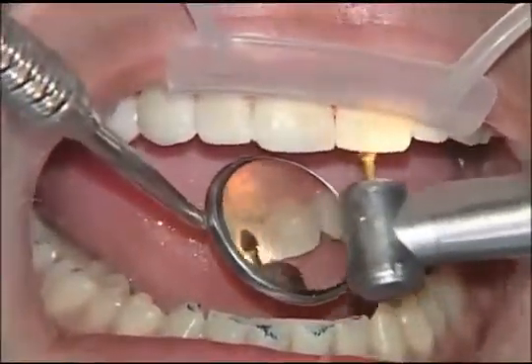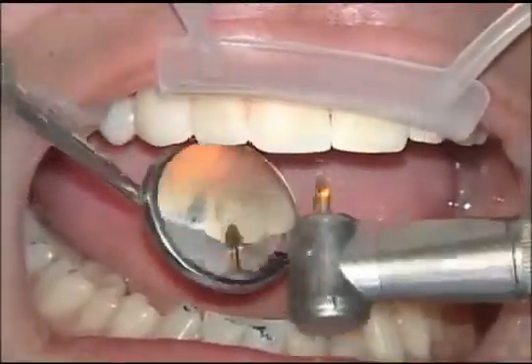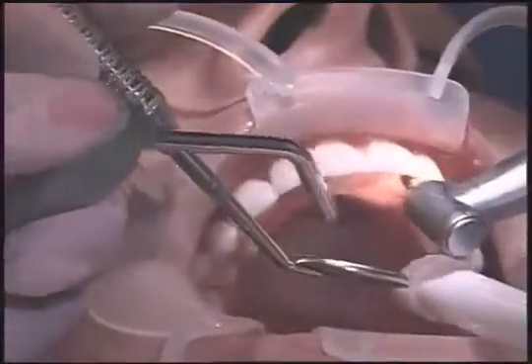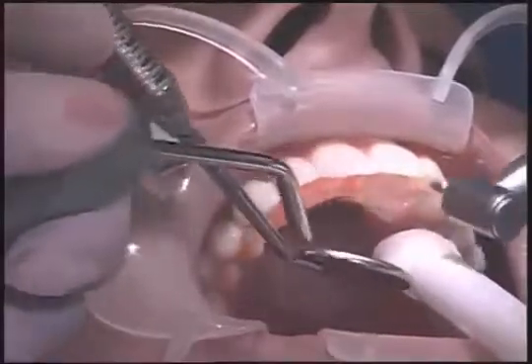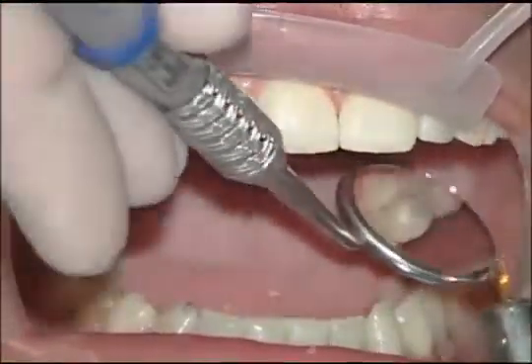So we use the 7408 to not only remove any excess cement, but to take care of any excursive areas that we want to remove from the ceramic material, or in fact if we do have a high spot. The 7408 at relatively slow speeds does a good job of removing ceramic material without causing a lot of the roughness that you can have with something like a diamond.